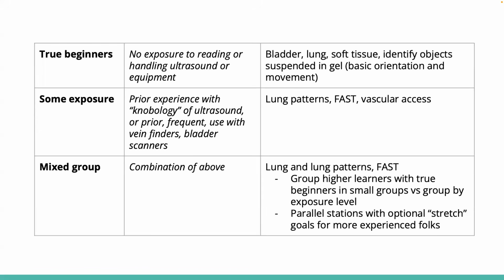Or you can keep them all at the same exposure level, which is also fairly helpful. I think you just don't want to have someone who knows a whole bunch about how to do ultrasound and someone who just doesn't know anything. You still want to have close-ish exposure levels.